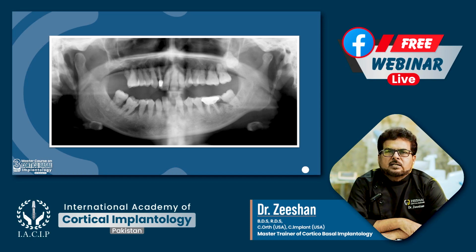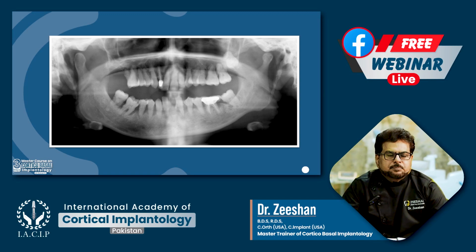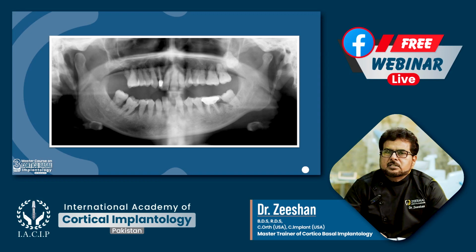They all are supposed to be well skilled surgical protocol, and you have to develop that surgical skill. First you have to learn how to do it, and then you have to engage them in the second cortex. You have to focus about the second cortex. So after extraction of this case, how we can fix the implants and then load them immediately within 72 hours.